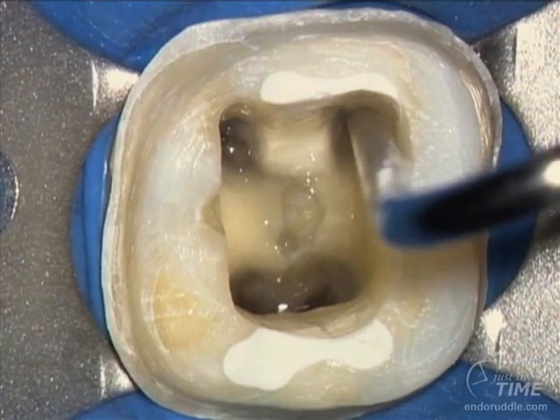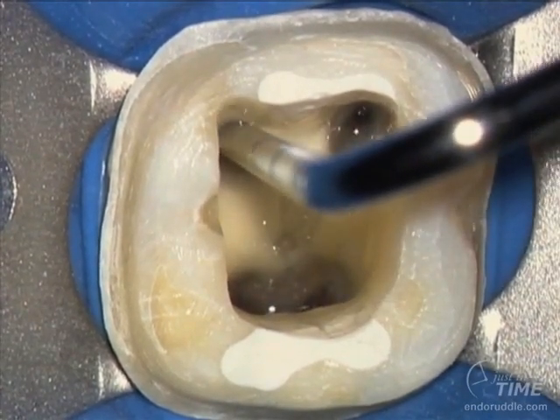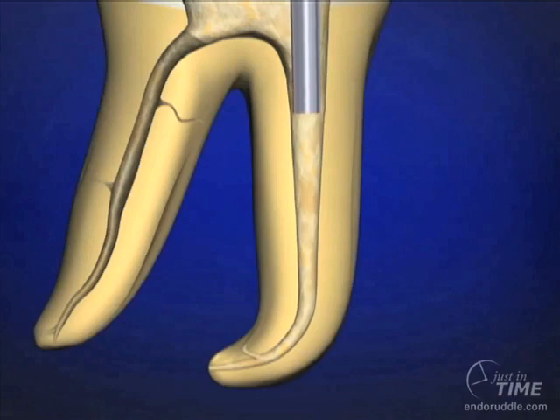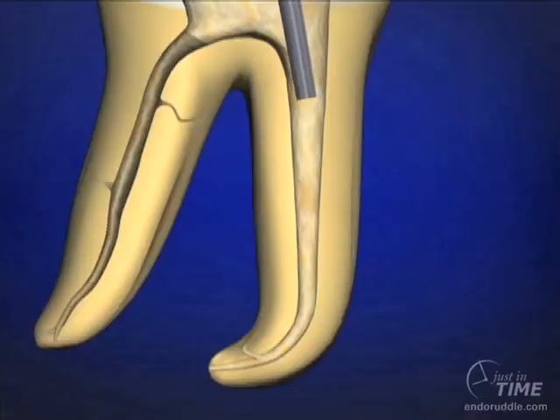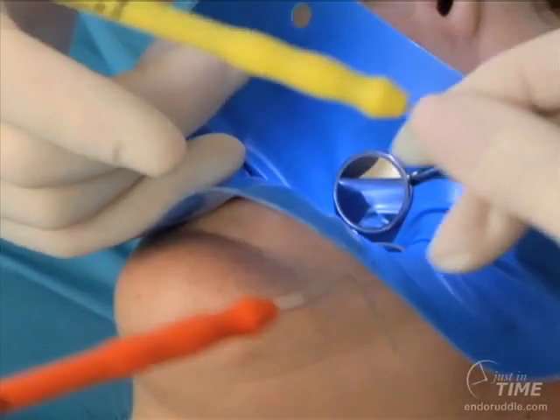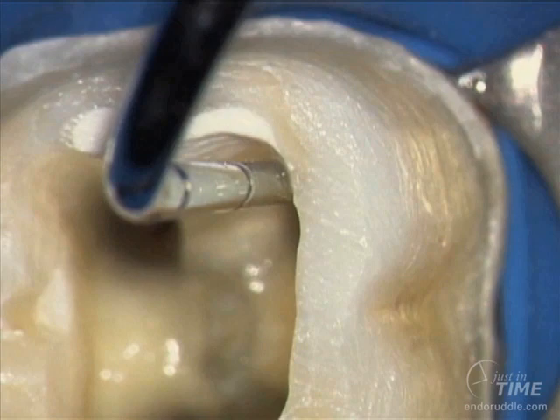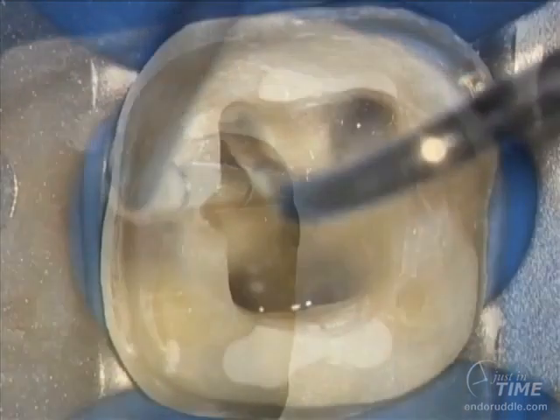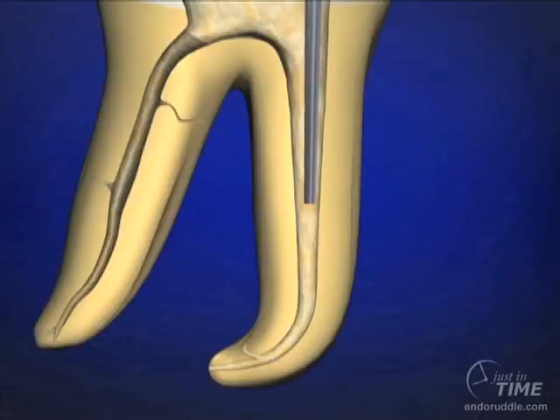We need to fit our pluggers. We fit the biggest plugger in the coronal one-third that fits loosely, then a smaller diameter plugger for the middle one-third — it needs to be loose, unrestricted by unyielding dentinal walls. Finally, we fit a 0.5 plugger 15 millimeters off the reference point, which means we can move gutta percha to at least the 20 millimeter level.